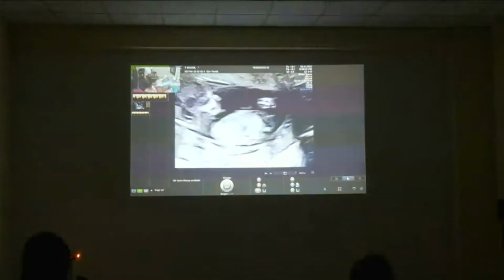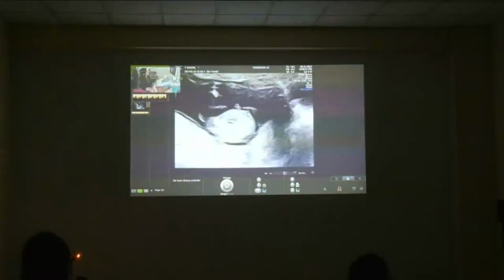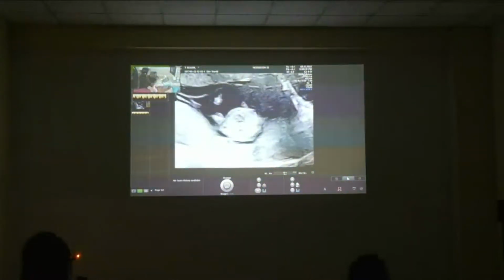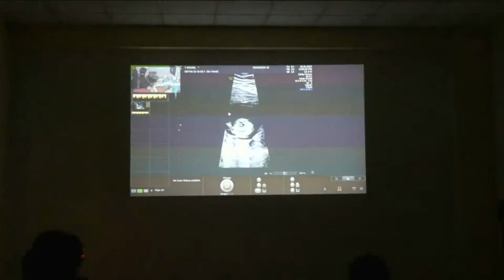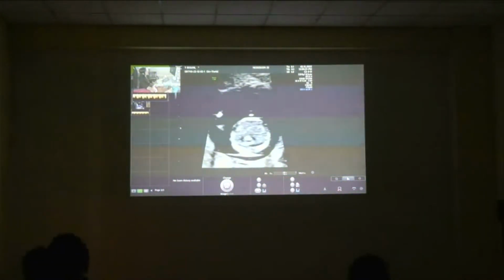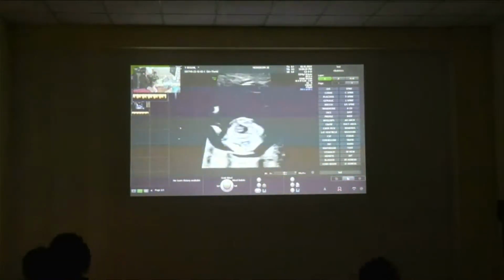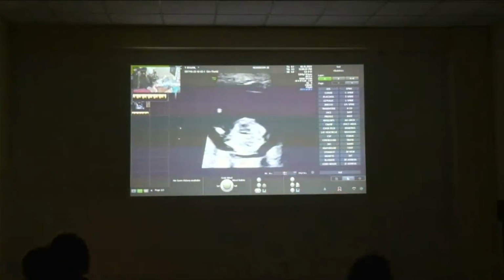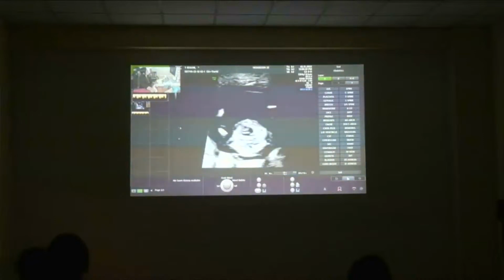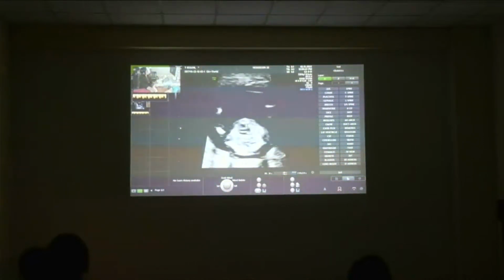So after the ductus venosus, we have recorded 3 aneuploidy markers. Now look at the fetal heart. Look at the situs first. This is the stomach. And we see that the heart apex is also pointing towards the stomach, towards the left, so the situs is normal. We have to try and document this sector. So we know that this is the left side and this is the right side, and the tricuspid valve is here.